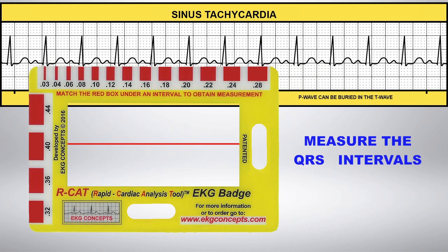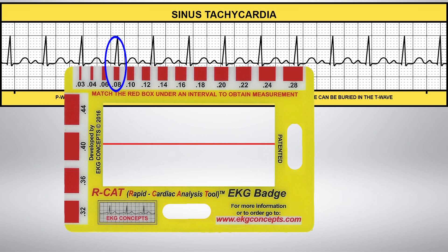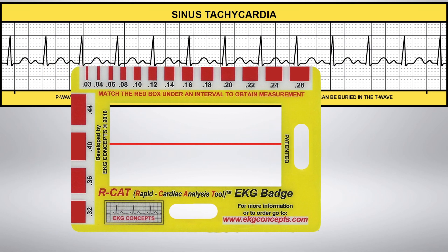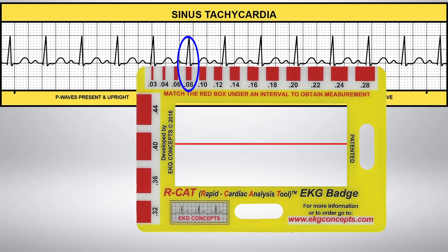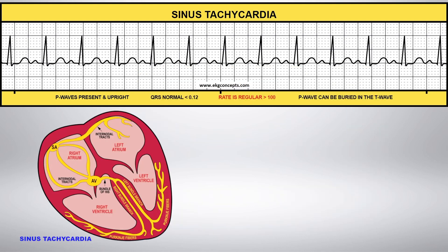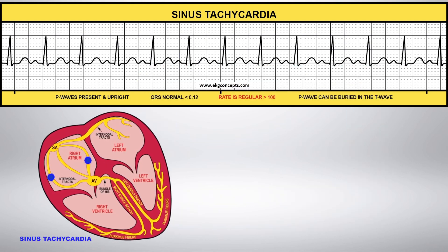Now using the calibrated red boxes, slide the badge over to measure the QRS intervals. The QRS intervals are consistently 0.08, which is in the normal range of less than 0.12.